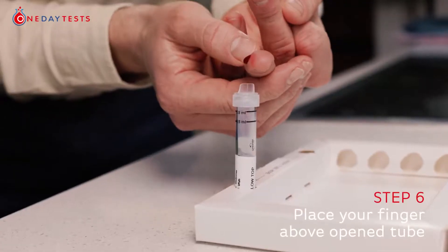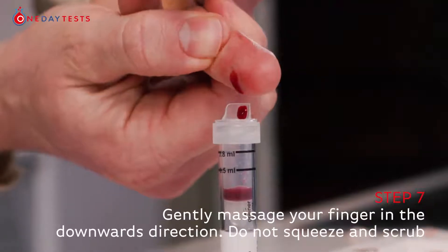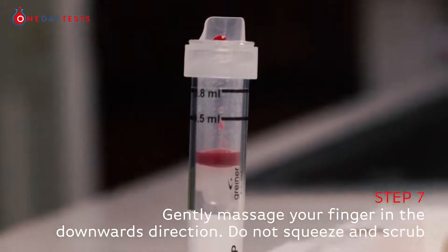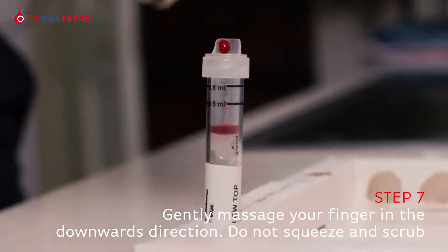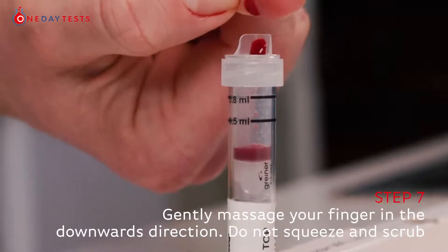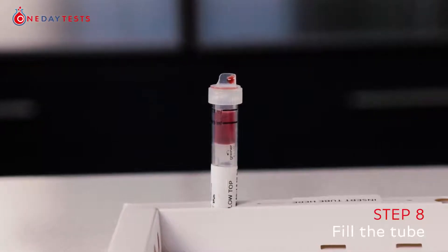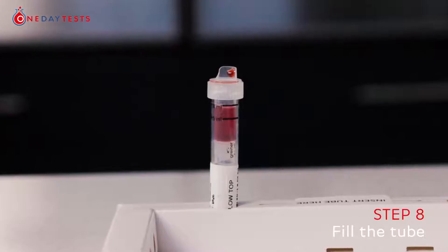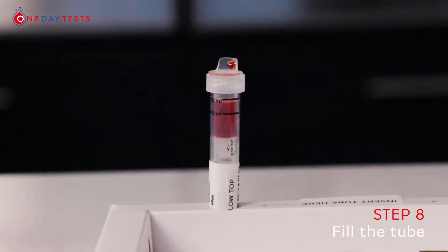Keep your finger pointing downwards and place it above the open tube. Gently massage your finger in a downwards direction, but do not squeeze the fingertip. Aim for the blood drops to lightly touch the inside of the tube lip. Continue massaging your finger — do not scrub your finger on the tube lip. Scraping and squeezing the collection area will damage the blood cells and prevent accurate results. Fill your collection tube to between the two black lines marked on the tube. If you have not collected enough blood or you need to fill a second tube, use the next finger with a new lancet. Do not use your thumb or little finger.